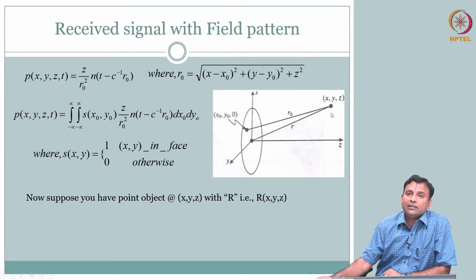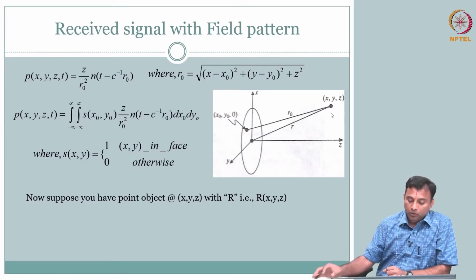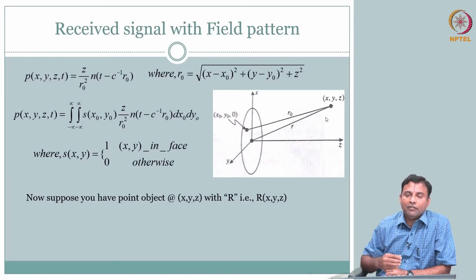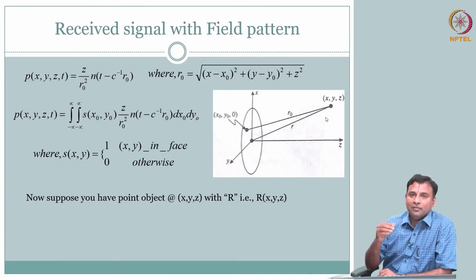What are we interested in? We are interested in pulse echo. So, what is going to come back? If I pretend now this point has some reflectivity, then what did we see? Oh, reflection coefficient. You send a signal, and what you get back is the incident times a reflection coefficient, PR by Pi, receive over incident, that is your reflection coefficient. So, PR is going to be incident times reflection coefficient.